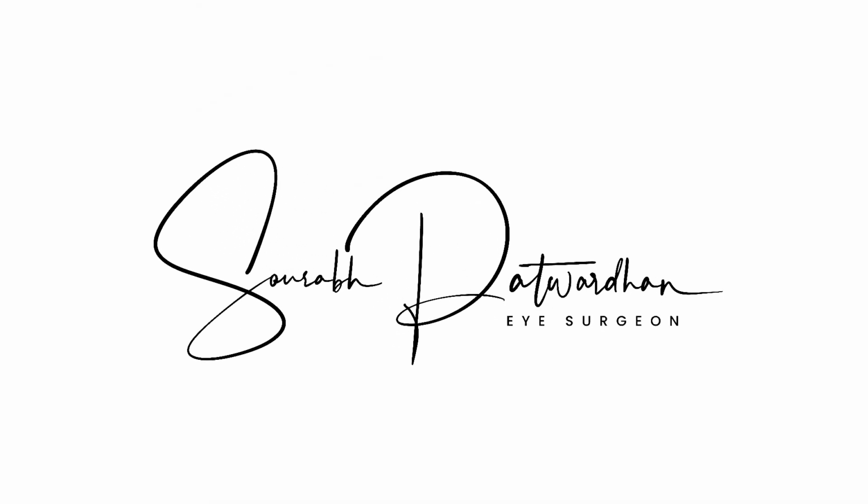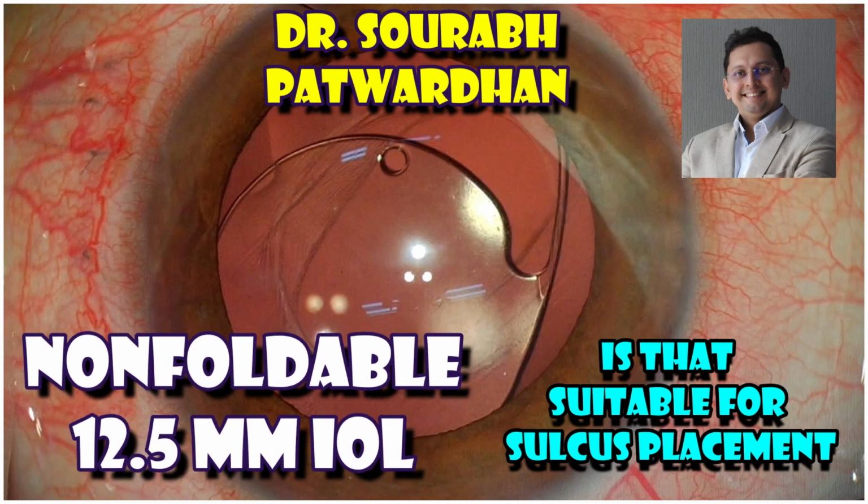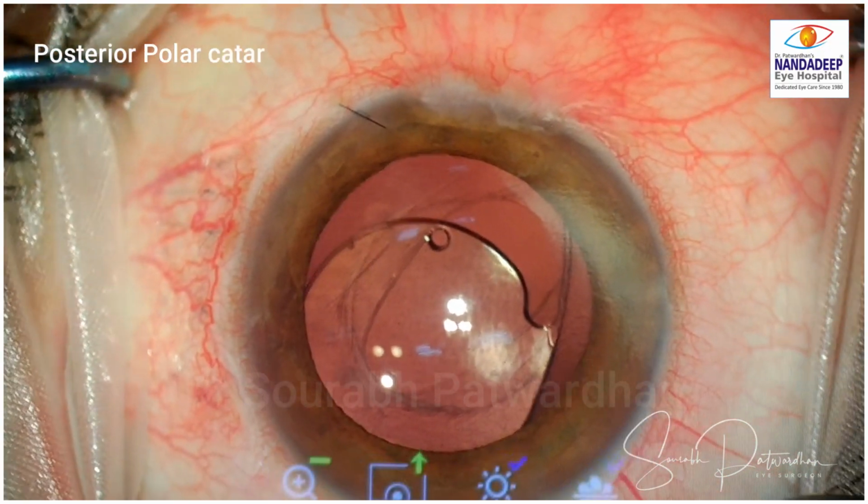When there is a PC defect and we have to place the IOL in the sulcus, most commonly we use a non-foldable larger optic IOL, which is the least expensive option for us.